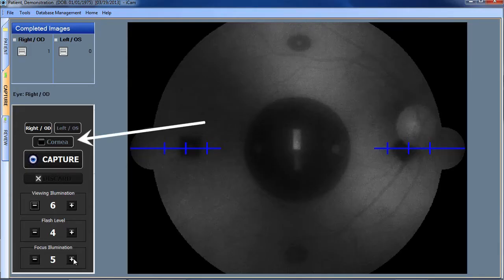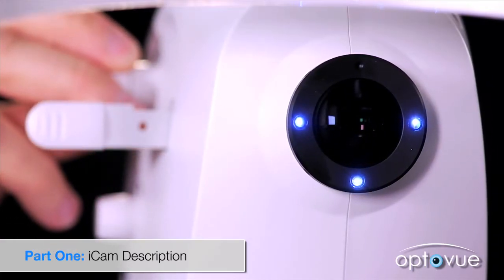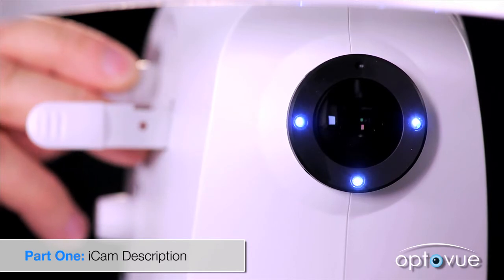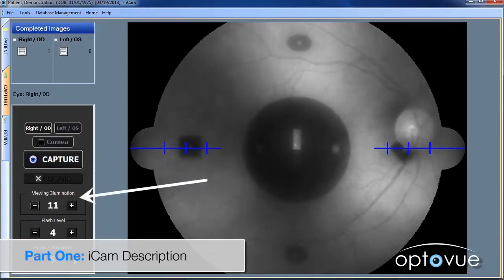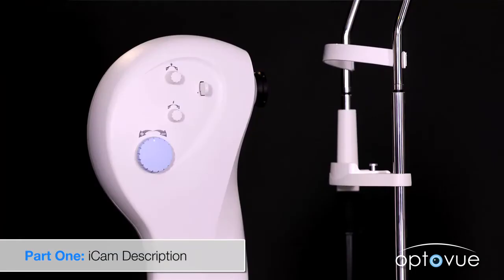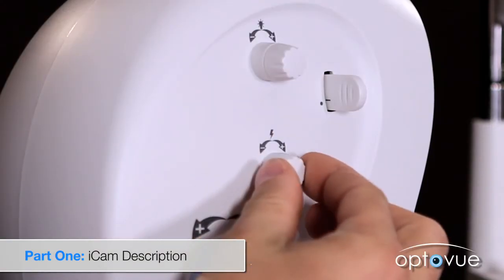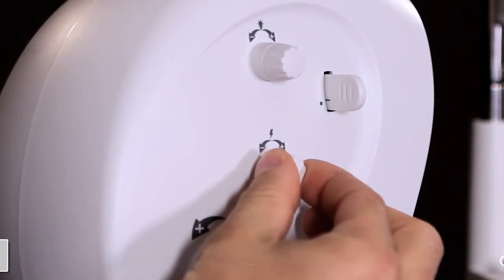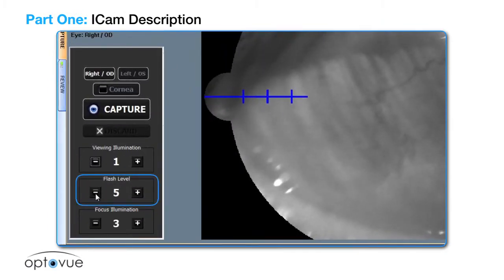If you select the cornea button in the software display, this knob controls the intensity of the three external LED lights, also with a range of 1 to 12. Both of these functions can also be controlled using the mouse and screen display. The next control knob down is the flash intensity setting with a range from 1 to 12, which can also be controlled using the mouse and flash level selections on the computer screen.